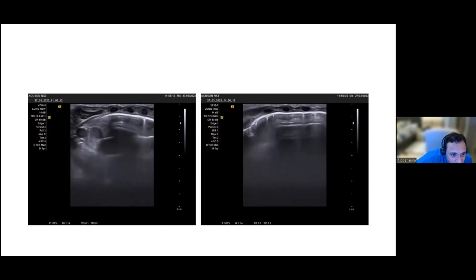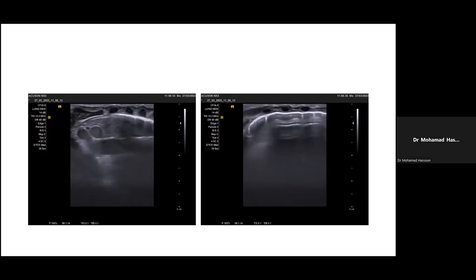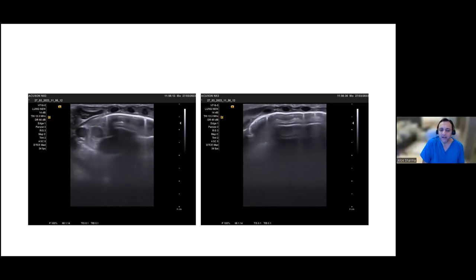Sliding is definitely visible on your frame rate. And yeah, I can see an A profile with a kind of a B line to the right of the screen. So you're having, and this is a very common theme, and it happens to all of us, and Naz was having the same problems. At the moment, you're losing out on depth. You're losing the deep half of the lung. And that's probably because you need to change the frequency a bit, but also because your focus, again, is probably at the level of the pleura.